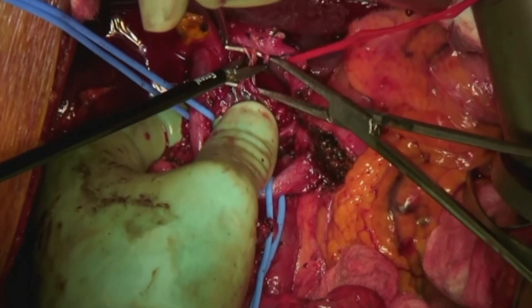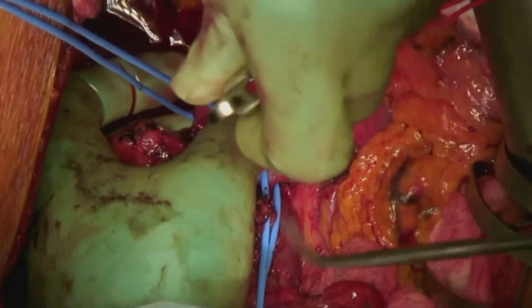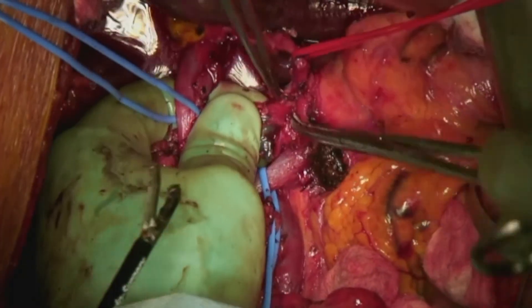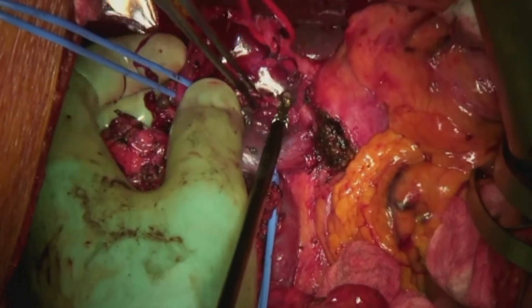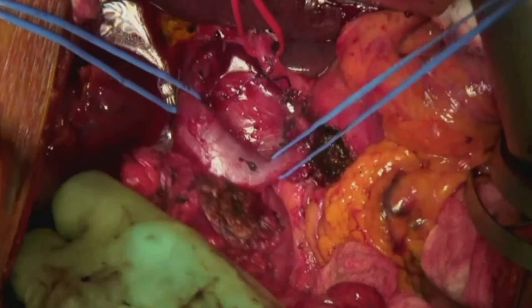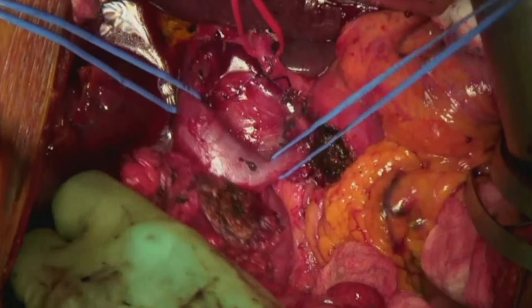Control of the common hepatic artery with a vessel loop greatly facilitates this dissection. Once this tissue is free of the common hepatic artery, it will be flipped down to be resected with the rest of the specimen. Dissection is then carried back toward the origin of the common hepatic artery and toward the origin of the superior mesenteric artery, where the dissection plane connects with the previously performed Kocher maneuver so that the origin of the superior mesenteric artery can be fully delineated. The coronary vein will often be encountered in this space and should be preserved when possible. With these steps completed, the cephalad aspect of the superior mesenteric artery has been clearly defined and conditions are ideal for the SMA dissection.